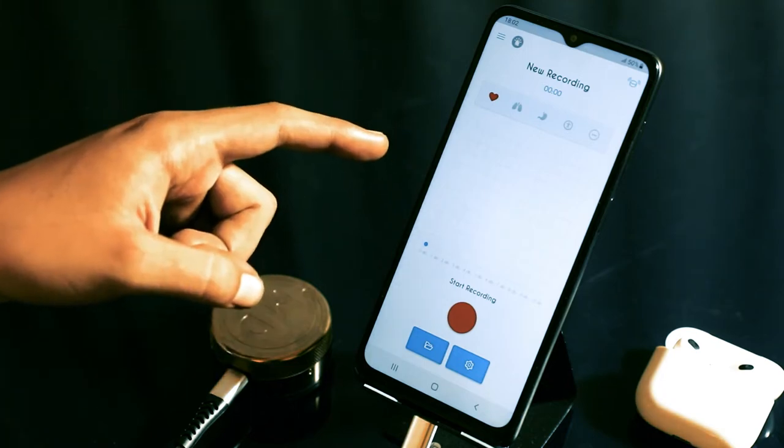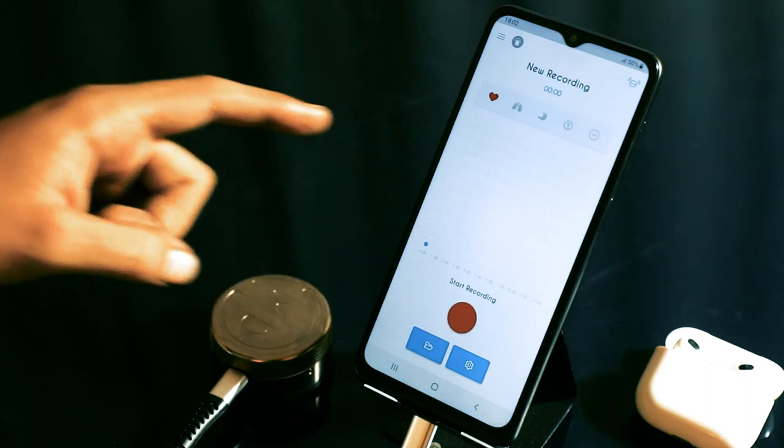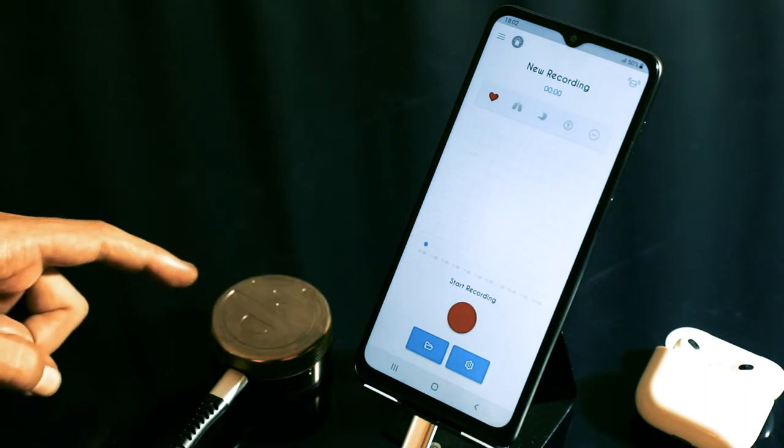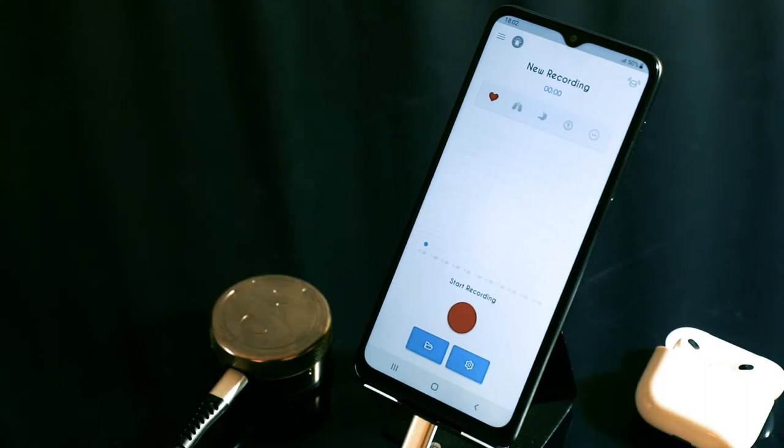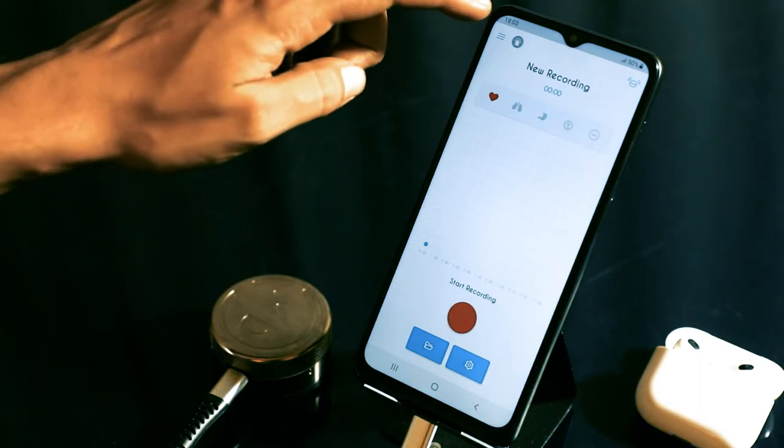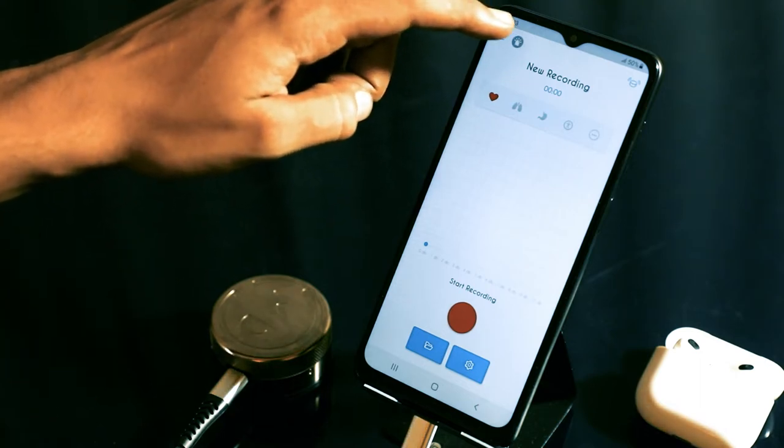This is the main screen from where you can record sounds from the Tal Digital Stethoscope. Today, we're going to discuss all the features on the Tal app, starting with the emergency recording button.